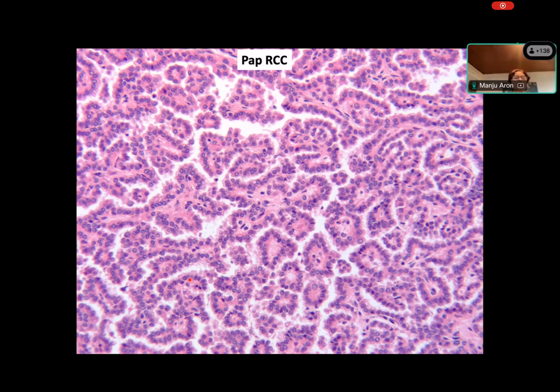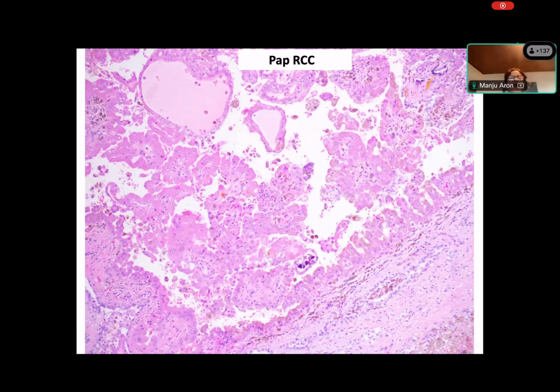Now, this is an example of papillary RCCs. Again, a very broad morphological differential diagnosis. You can have lots of different morphology in papillary renal cell carcinoma. You can have cells like this, which are more cuboidal in appearance with scant cytoplasm, almost kind of amphophilic kind of cytoplasm with hyalinized kind of stroma, or you can have macrophages within them, or you can have tumors like this, which are very different, higher grade pink tumors.